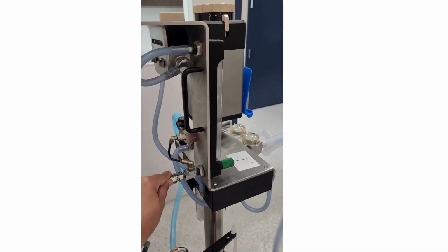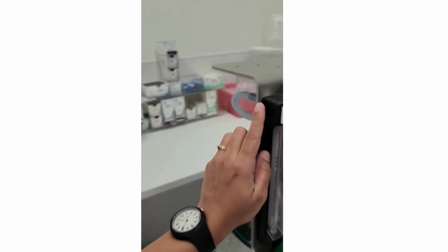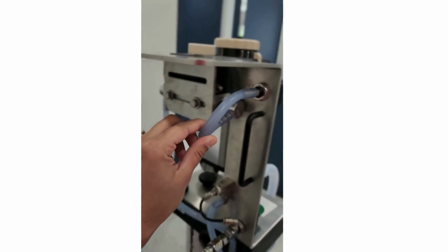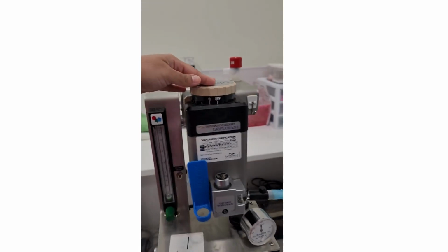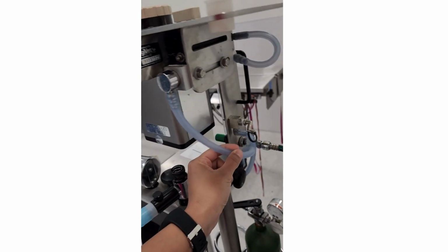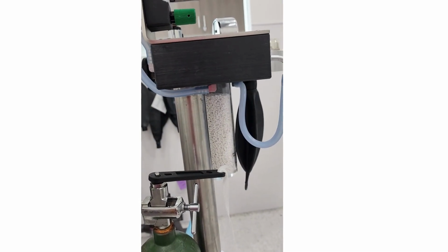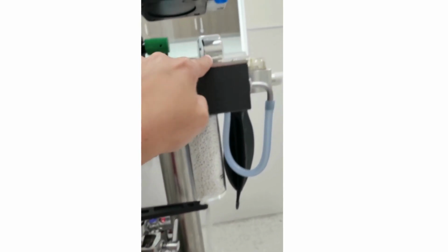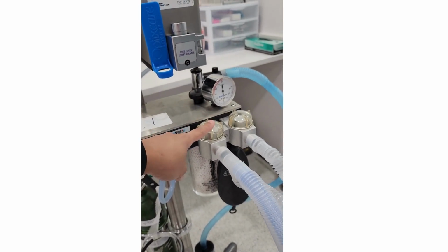The first path will be to the flow meter. The flow meter will reduce the pressure even further to around 12 psi, which is more suitable for the patient. Here you can regulate the amount of oxygen that will enter the vaporizer. In the vaporizer, the oxygen is mixed with the liquid anesthetic and formed into a gas. And from here, it'll go to the vaporizer outlet. From the vaporizer outlet, the gas will reach the inspiration valve, which is a one-way valve, then to the inspiration hose, and then to the patient.